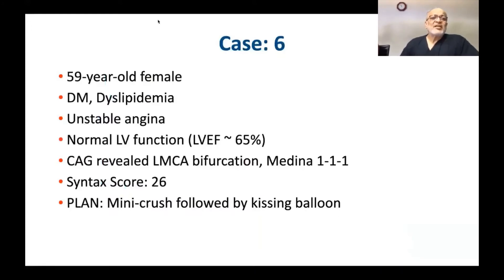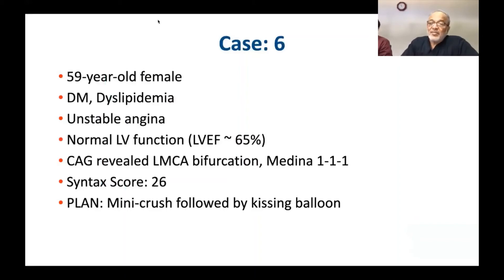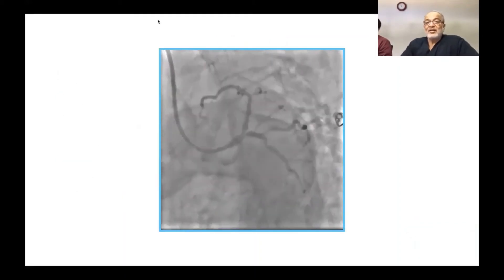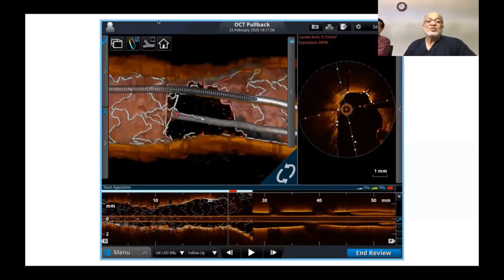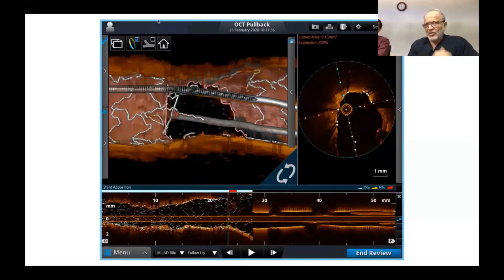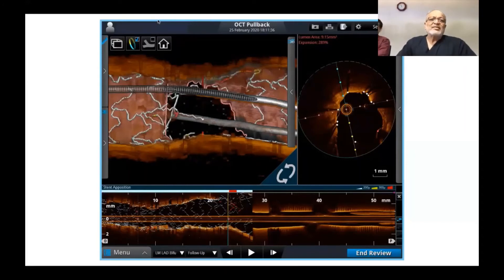A 59-year-old female, diabetic, dyslipidemic, unstable angina, normal ventricular function, LMCA bifurcation Medina 111, syntax score 26. Plan: mini crush followed by kissing balloon. The patient had ongoing pain so there was no time to ensure distal crossing. Final OCT runs after the procedure showed proximal crossing and link-connecting carina with some crowding, but a good lumen.